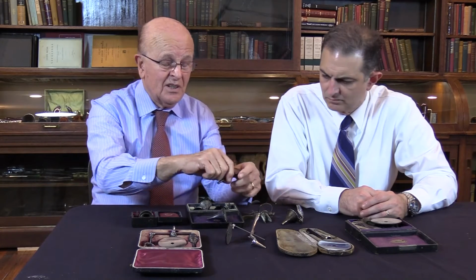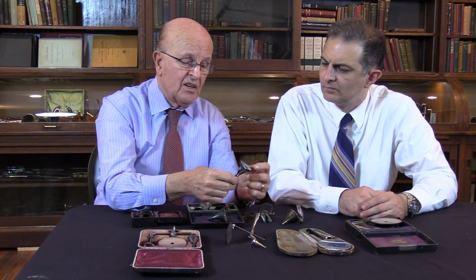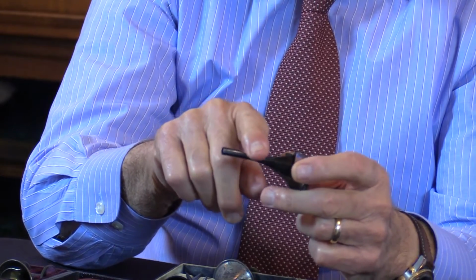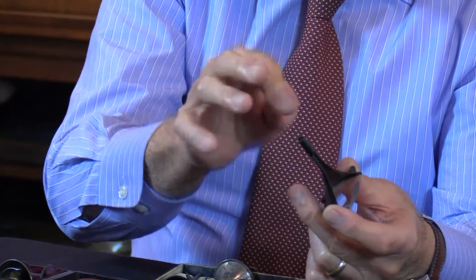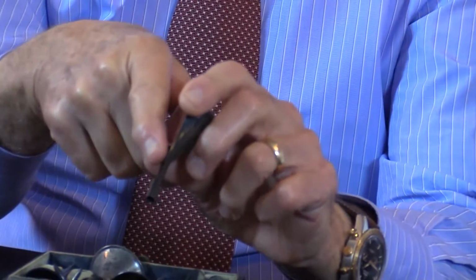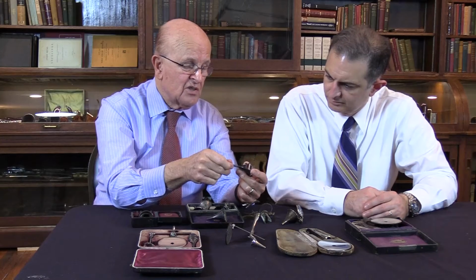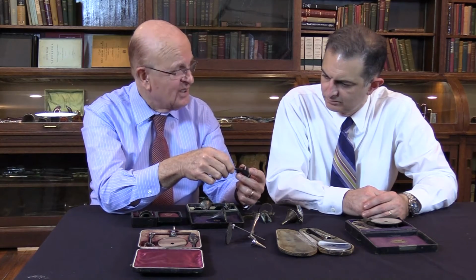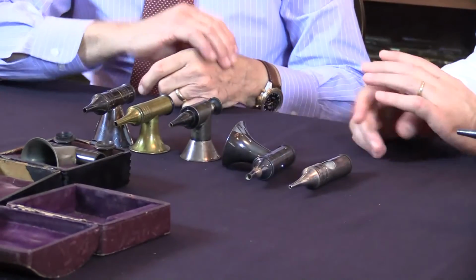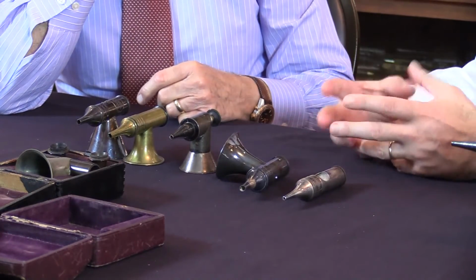I think this is, to me, an amazing ear speculum, because it has a magnifying glass, but they cut the top here. This is the low ear speculum, the long one that we showed before. But you can see the magnified eardrum here and introduce the instrument through this opening. So this is one of the earliest we can see. We're going to see later an example of electric otoscopes that try to do the same thing. So over time, they needed to figure out other ways to enclose everything in one device.